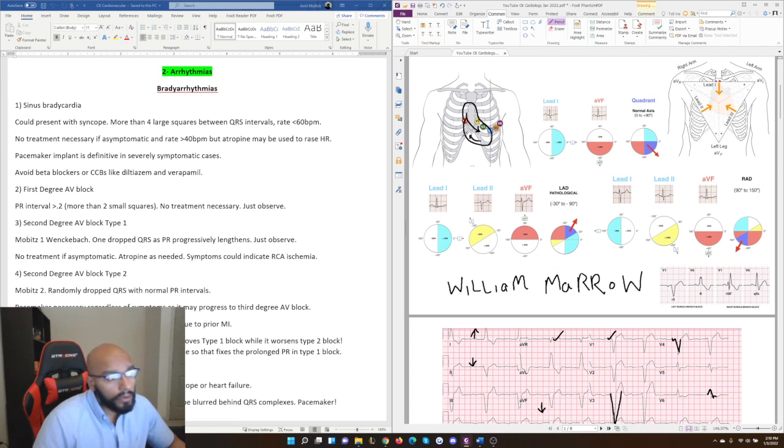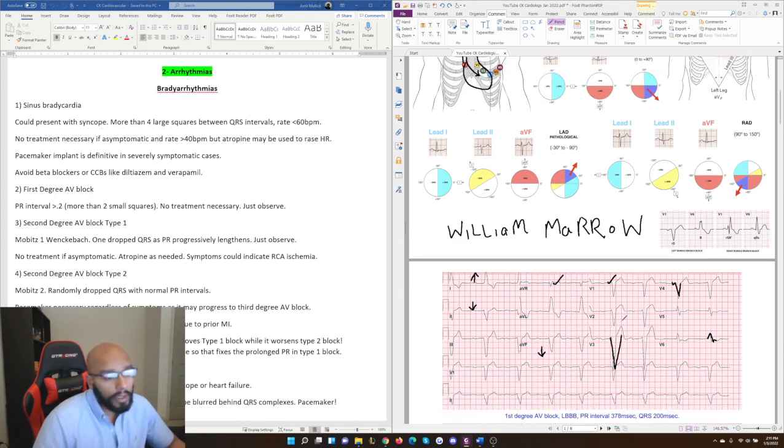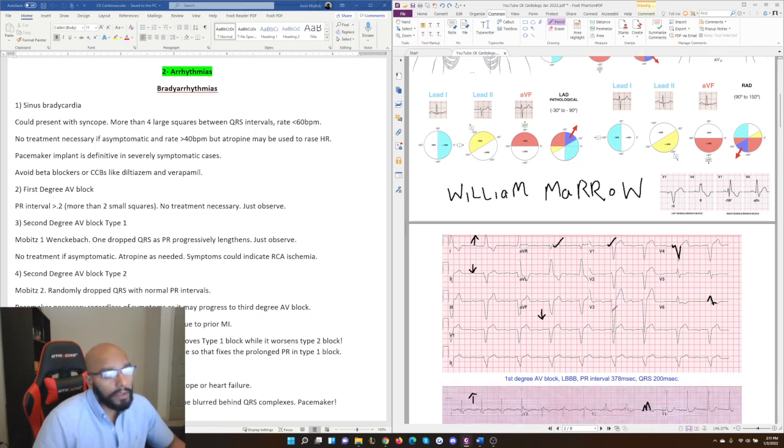Going strongly towards your right ventricle, and if that's happening, then it's not going towards the left ventricle at all, okay? Because if it was going towards the left ventricle, it would be going towards the lead, and it would actually point up correctly, but it's not. All right, so that's a sign that there's a left bundle branch block.